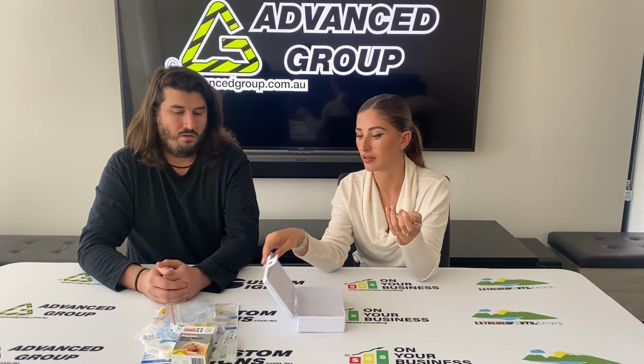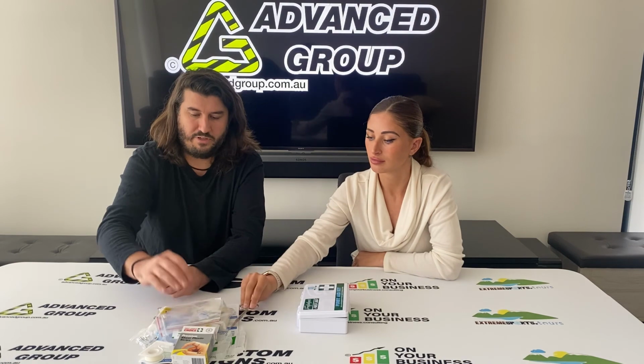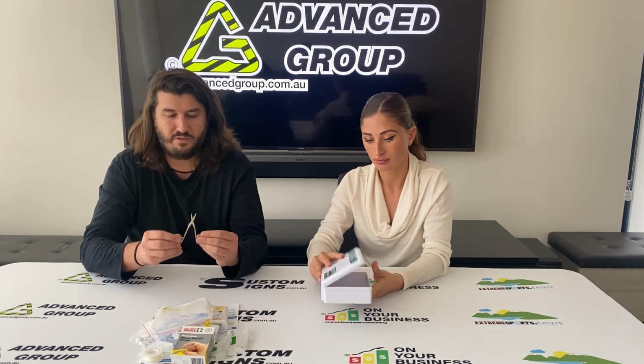Yeah. And we've got some scissors here. Is this just to cut? What would this be for? So if you needed to cut up any of the bandages, you would definitely be able to use that for cutting up some bandages. There's not really a great range of uses for them. That would be handy in certain small situations, or you could cut the tape. You could cut a bandage. So it's not a very wide application use. It'd be very limited because they're probably not the best scissors for anything other than cutting some very basic things.